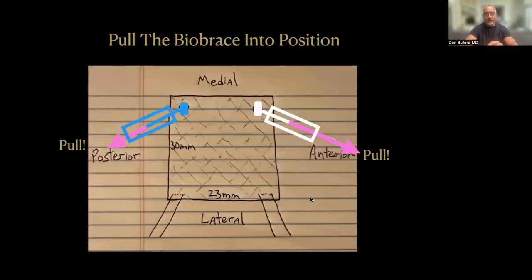Now it's time to bring the BioBrace into the subacromial space. After we've already nicked the inner diaphragm with that 11-blade scalpel, this becomes very easy — we just pull on the posterior and anterior sutures, each coming out of the respective cannulas, and as we pull those sutures, the BioBrace goes down through the cannula. We can chase it with a grasper using an atraumatic hands-off technique on the graft.